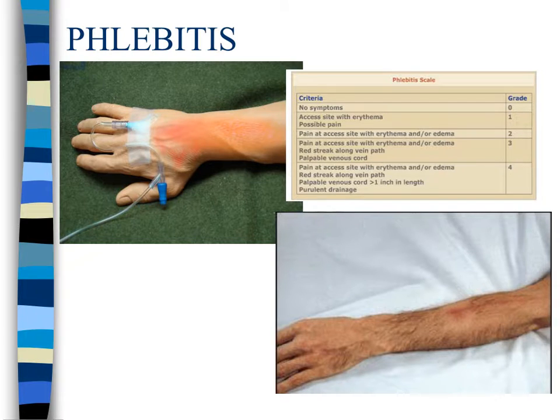Prevention is using larger veins for hypertonic solutions, choosing the smallest catheter appropriate, always using good hand hygiene, adding a buffer or extra diluent to irritating solutions, changing solution containers minimally every 24 hours, rotating infusion sites every 72 hours, and larger syringes such as 10 milliliters have less PSI, so this size syringe should be used to prevent damage to the inside of the vein wall.